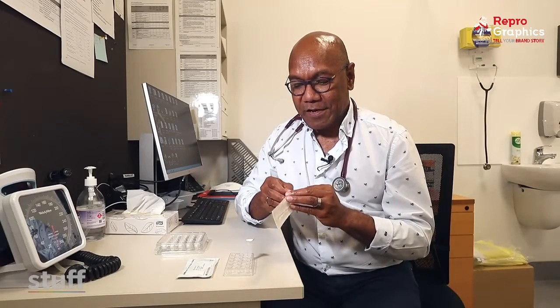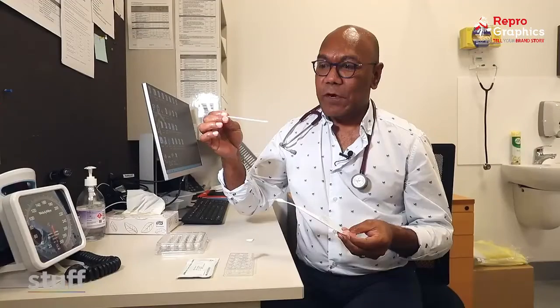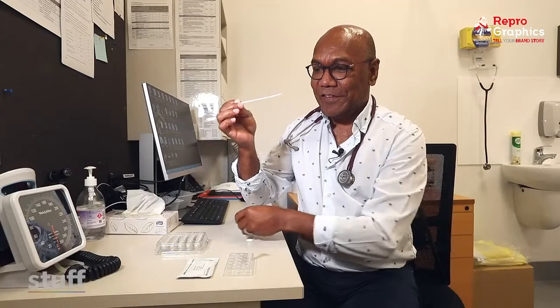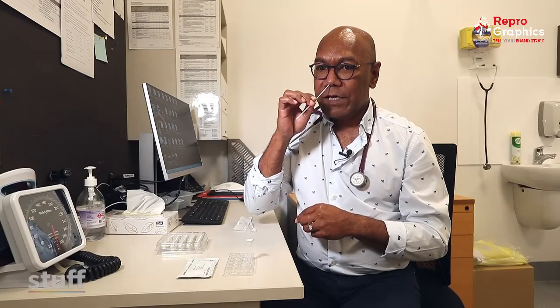The first thing you do is to open up the swab. You'll see the swab, and the soft end is what you put into your nostril. Holding it there, round it around four times.